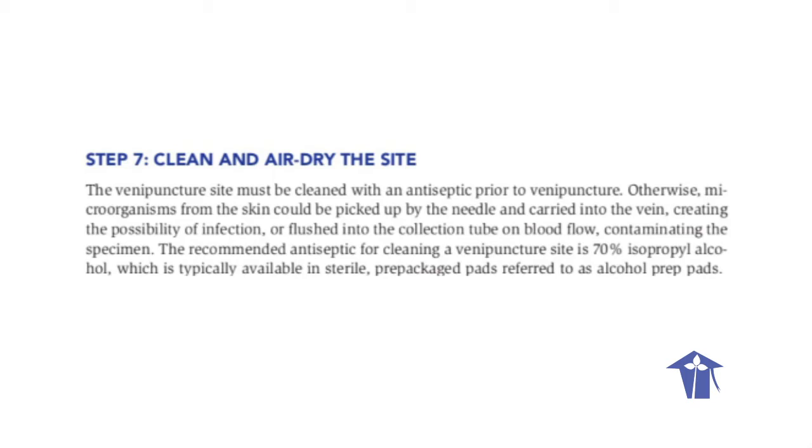The venipuncture site must be cleaned with an antiseptic prior to venipuncture. Otherwise, microorganisms from the skin could be picked up by the needle and carried into the vein, creating the possibility of infection, or flushed into the collection tube on blood flow, contaminating the specimen. The recommended antiseptic for cleaning a venipuncture site is 70% isopropyl alcohol, which is typically available in sterile, prepackaged pads referred to as alcohol prep pads.